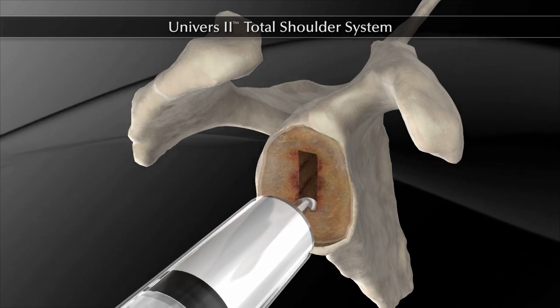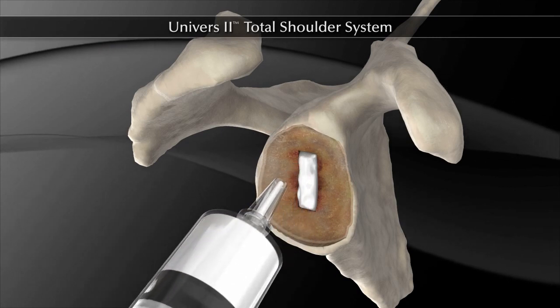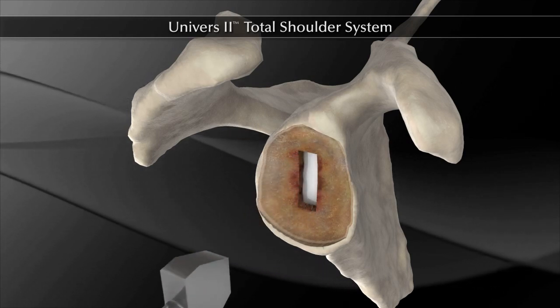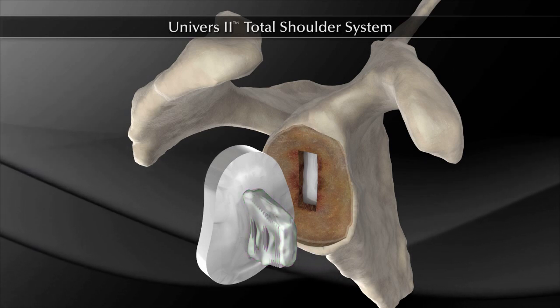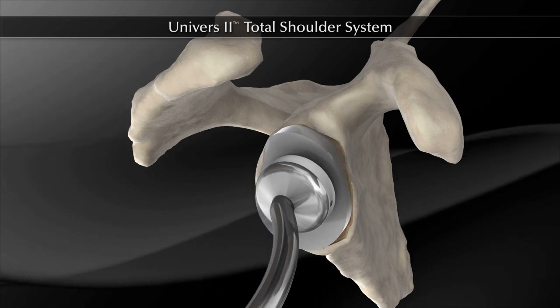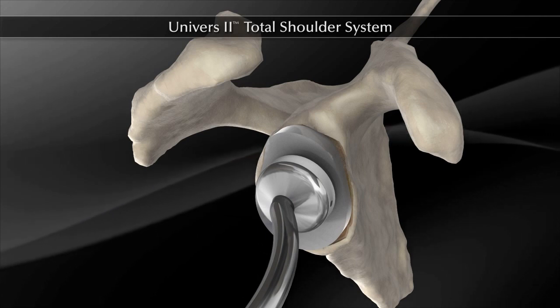Once the glenoid has been fully prepared, the bone slot is packed with cement to create good cement interdigitation within the glenoid vault. The appropriate size glenoid implant is opened and bone cement is pressed into the fenestrations on the implant keel. The keel of the implant is pushed into the cemented glenoid vault and impacted. The glenoid component is held firmly in place until the cement has cured.